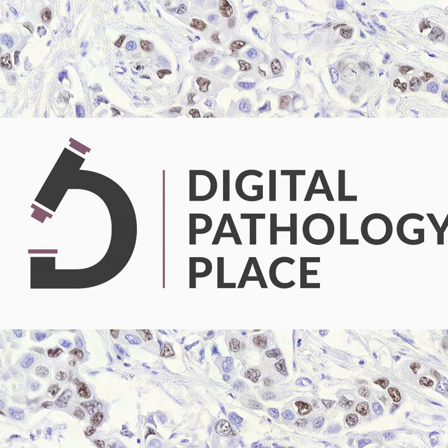Digitization, the scanner and its components. At the time of writing this book, digital pathology is being built on top of analog pathology. It means that tissue is processed, mounted on glass slides, and stained. Only then can it be digitized. Although there is significant research being done on glassless approaches in which the need for physical slides is reduced or eliminated, including fluorescent imaging of unprocessed specimens, almost all of the pathology work is based on H&E stained tissue samples mounted on glass slides. Scanning glass slides to create digital images is the first step in digital pathology.